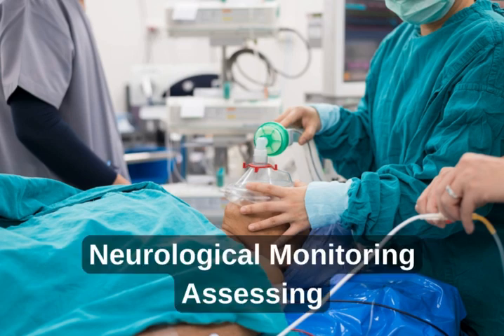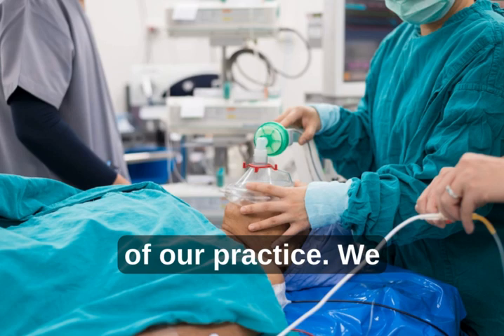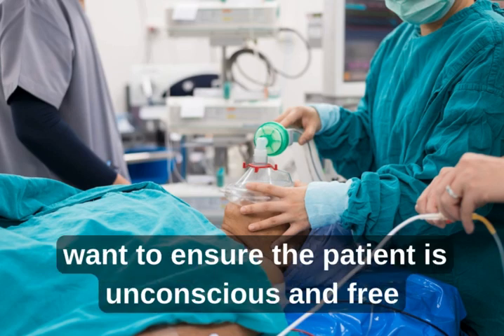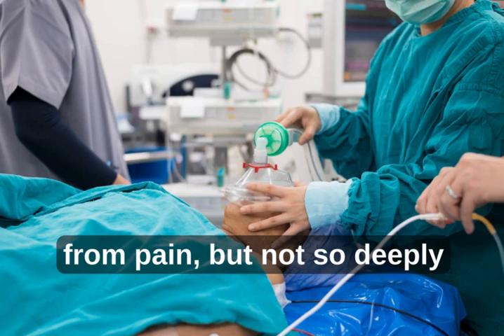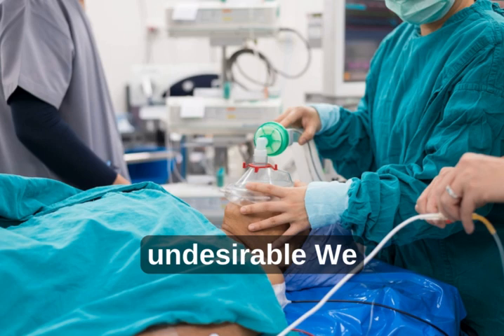3. Neurological monitoring. Assessing the depth of anesthesia is one of the most challenging aspects of our practice. We want to ensure the patient is unconscious and free from pain, but not so deeply anesthetized that they experience undesirable side effects or slow recovery.